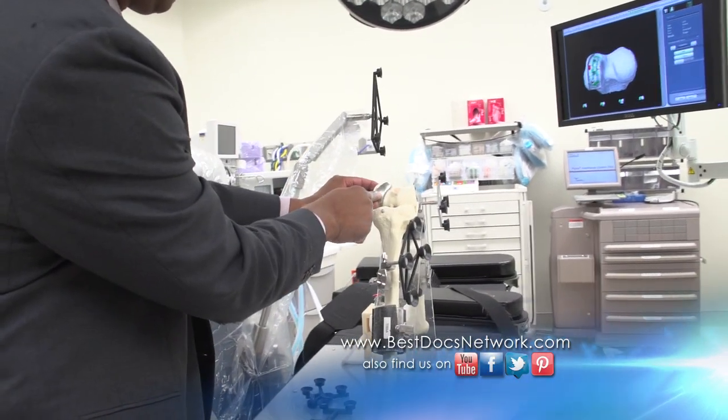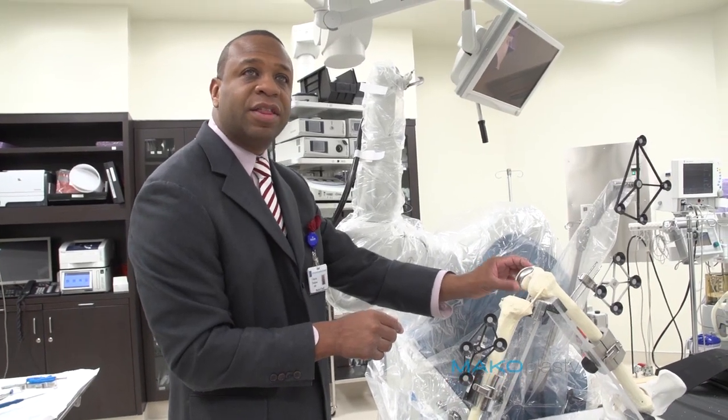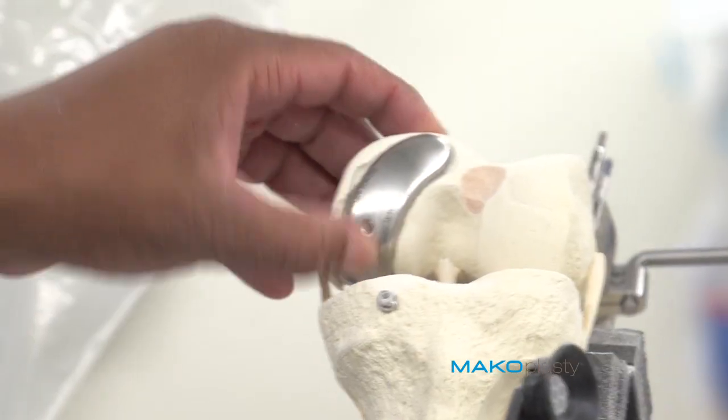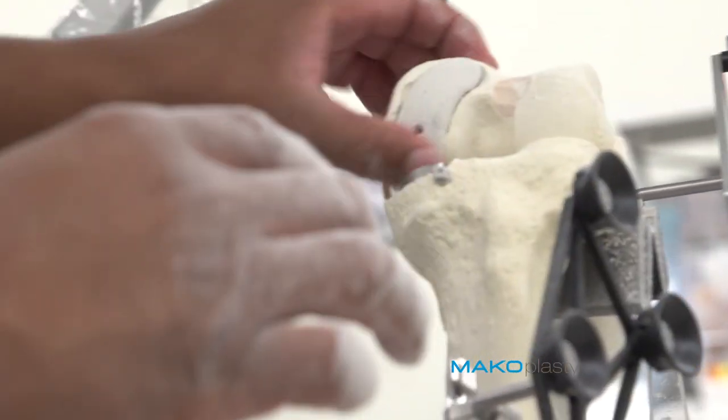The next step is to trial, or place, the implant to see if it fits correctly. As you can see, it's perfectly aligned. The rotation is perfect. And as a surgeon, it's very exciting to see that we can do this reproducibly, consistently, and successfully.